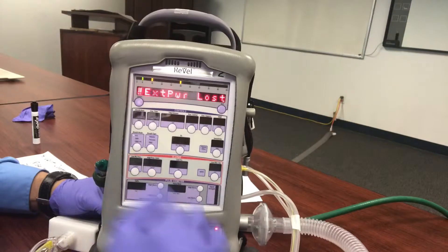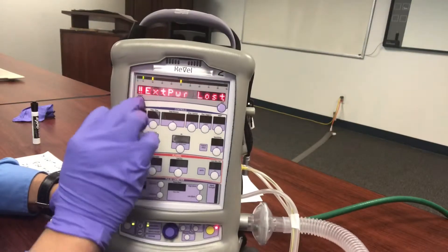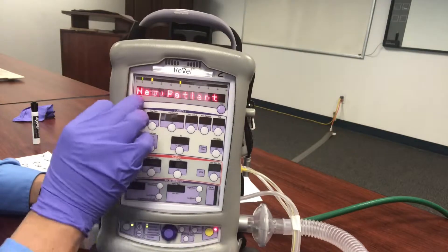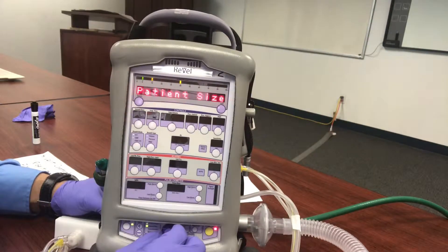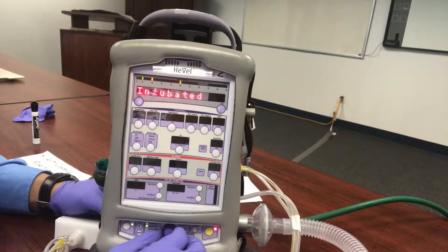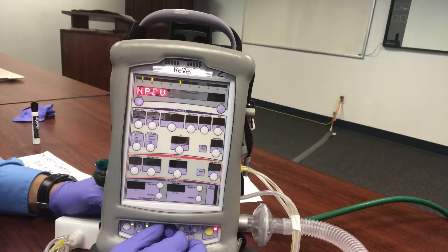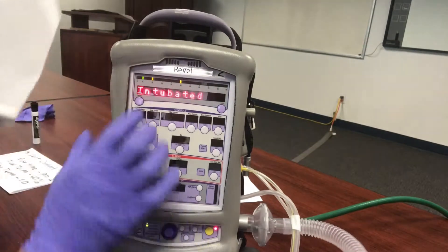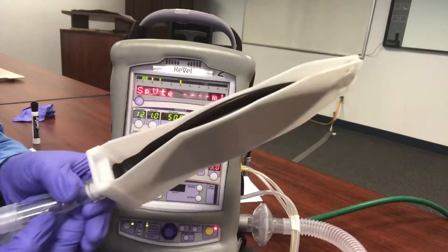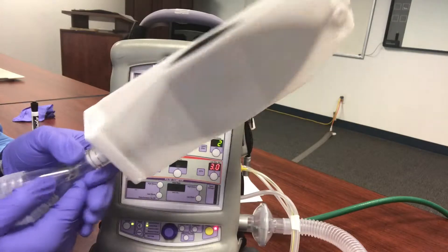We're going to silence the alarms and go to new patient. We'll scroll past patient ID, select adult patient size, and we're not going to do an intubated patient — we're going to do an NPPV patient. Let me show you quickly: if we do go to intubated patient, how quickly it gets started — it just fires up and delivers the breath immediately.